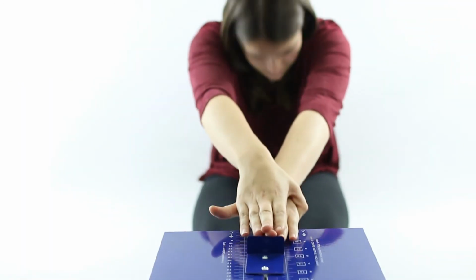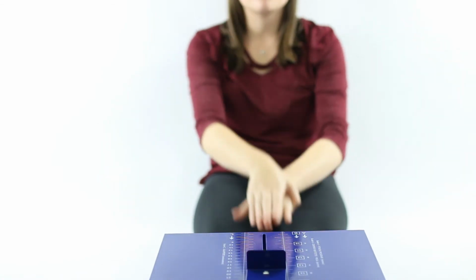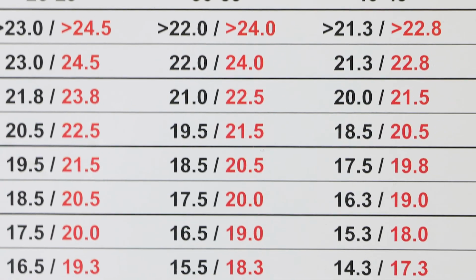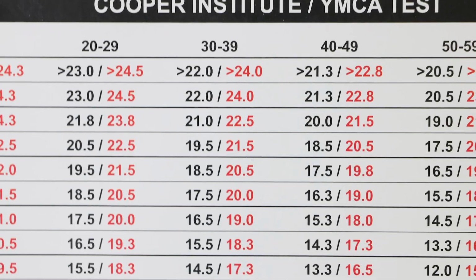The test should be repeated 3 times. The best of the 3 trials can be used to determine the level of flexibility. It displays measurements in both inches and centimeters. Look up your flexibility percentile ranking under the appropriate age and gender categories on the side of the flexibility tester.